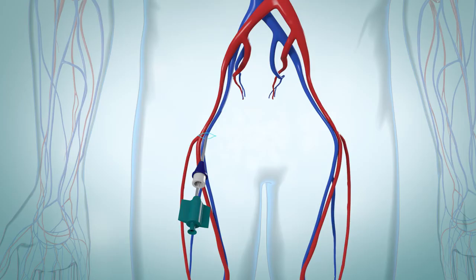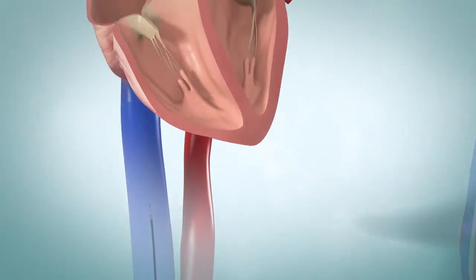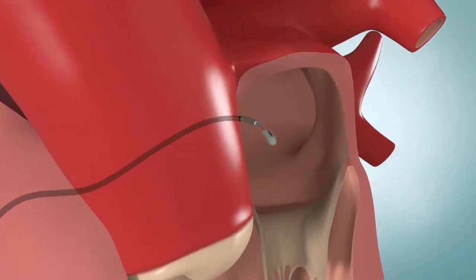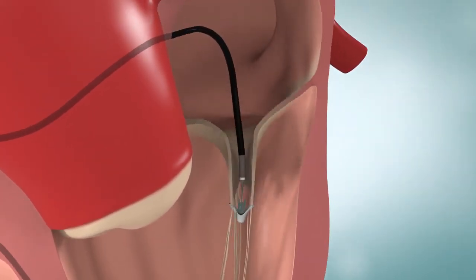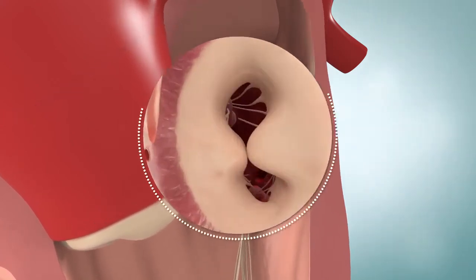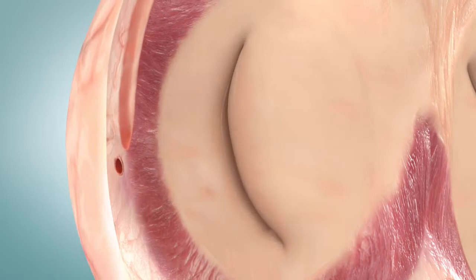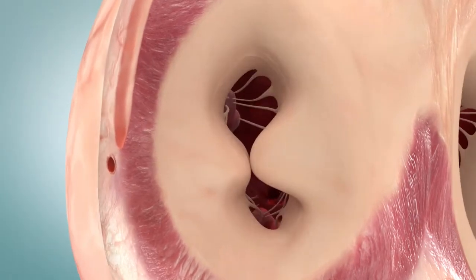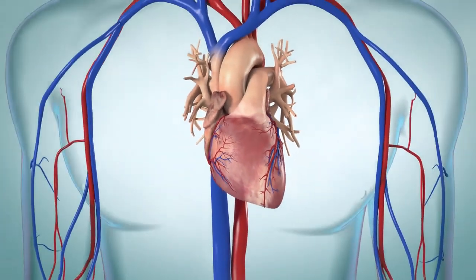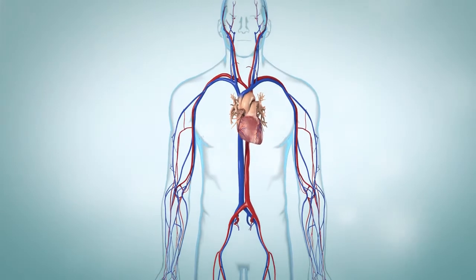If your mitral valve is leaking, your doctor may recommend repairs using a transcatheter approach. Your doctor will put a catheter into one of your blood vessels. The catheter will have a special clip device attached. Your doctor will guide the clip on the catheter to the leaking mitral valve. The clip will grasp the two sides of the mitral valve and close. This creates a double opening of the mitral valve. The clip still allows blood to flow on either side of it, but it greatly reduces the amount of leaking. After your healthcare provider completes the procedure, he or she will close the incisions.